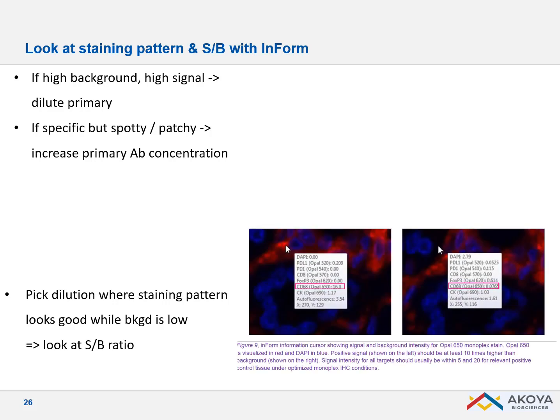With InForm and multispectral imaging, you can quantify your signal and subtract autofluorescence, giving you a very good idea of your signal-to-background ratio. We recommend a signal-to-background of at least 10. By hovering over the image, you can look at specific signal versus background and make sure you get the best signal-to-background as possible.